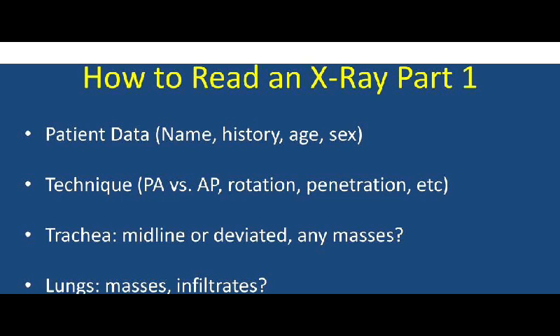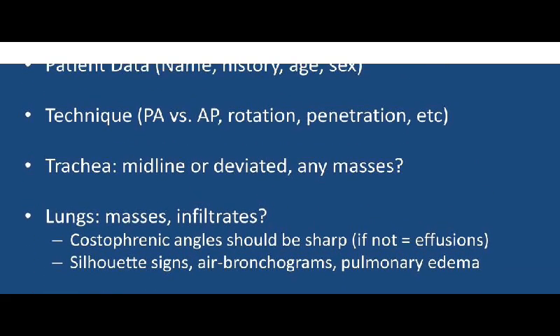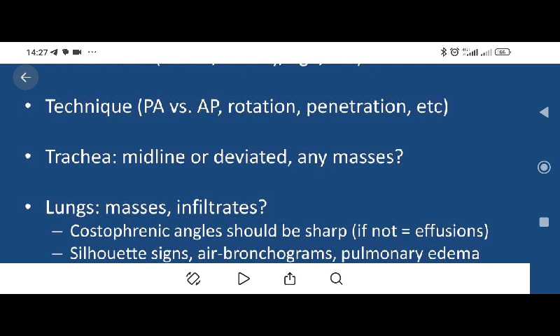So another one is technique. Ensure that the technique, normally in the radiography, you see that the technique is written there, whether it was PA, AP, rotation, all those things must be there. The special factors will also be there, so that if we are reading the image, we know we are working with a PA radiograph. If it's an AP, remember, in taking an AP, we should be expecting a magnified heart. So if I see it, I know, okay, it's the result of the AP image that was taken.